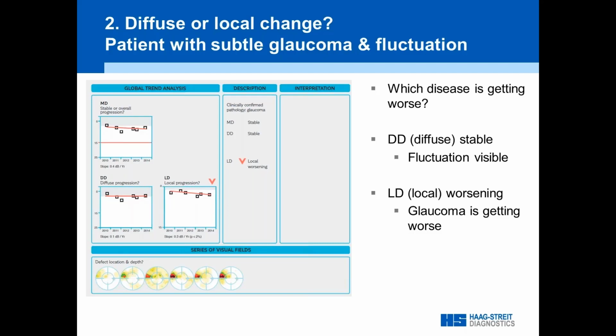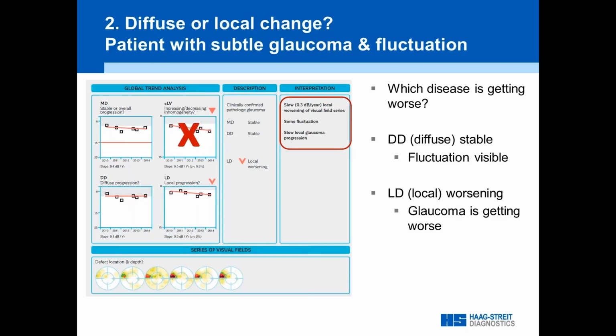So that's nice and helpful too. And again, the LD, SLV, sometimes it picks up the same, sometimes it doesn't. So I tend not to look at this.